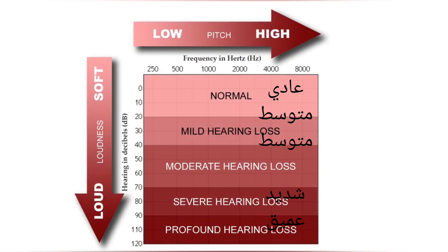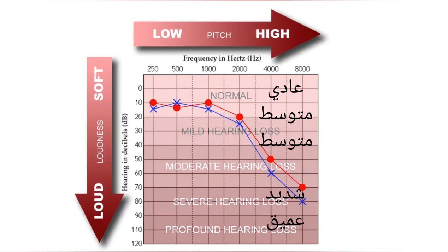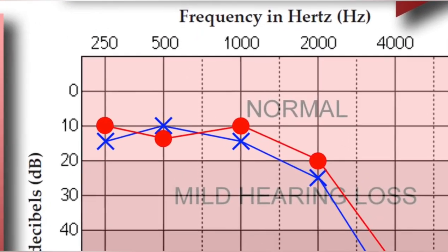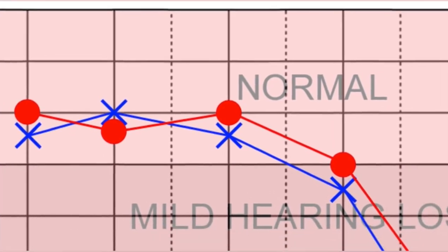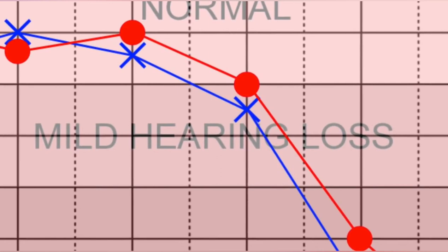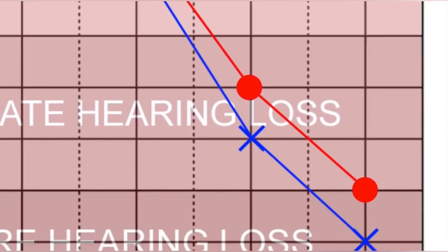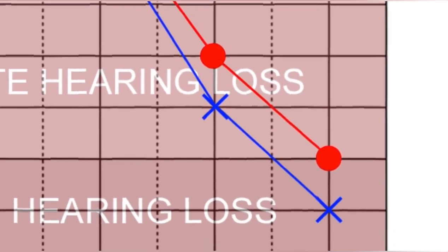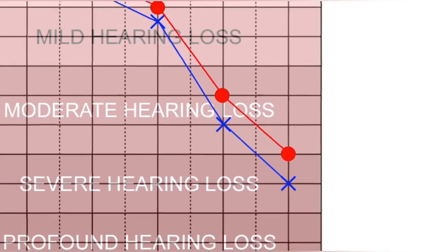Now that we know what the various parts of the audiogram are, let's take a look at a few examples. In our first example, you will notice that this person has hearing that falls into the normal range up to about 1500 hertz. At 2000 hertz, their hearing starts to make its way into the mild hearing loss category, more so for the left ear. At 4,000 hertz, there's a significant difference and the hearing is now in the moderate hearing loss category. At 8,000 hertz, this person's hearing falls into the severe hearing loss category.